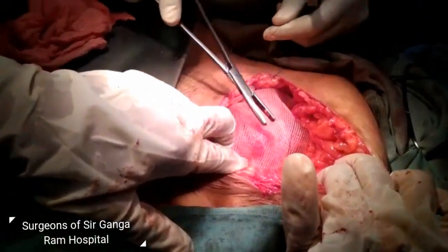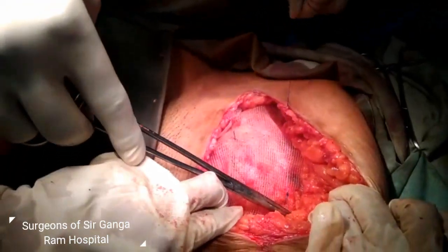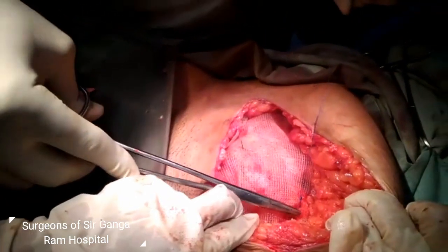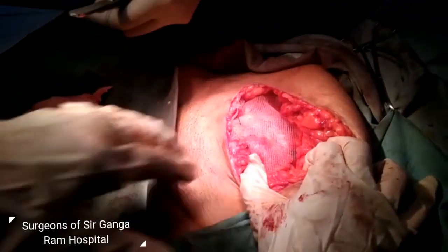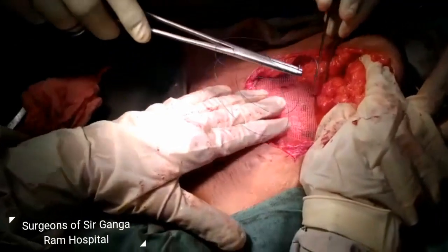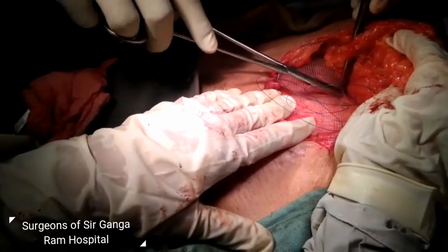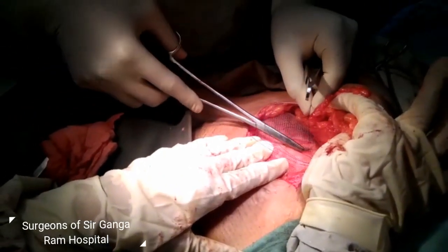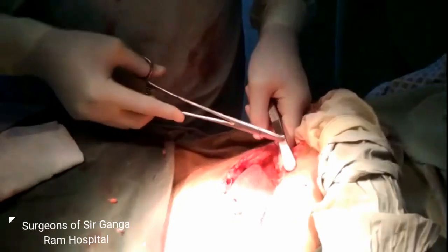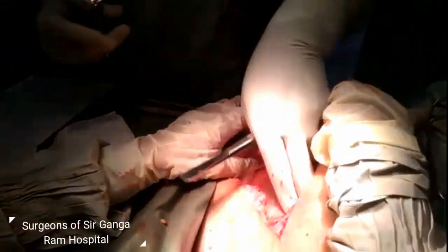Recurrence with mesh repair is very low. However, if you do primary tissue repair alone, recurrence chances are 40 to 50%. First, the defect is closed with Prolene 1, then we have placed a polypropylene mesh of 15 x 15 cm, covering 5 cm all around the repaired defect. With Prolene 2-0, after every 2 cm gap, you apply stitches to place the mesh.